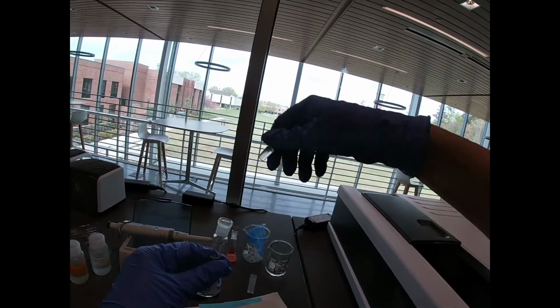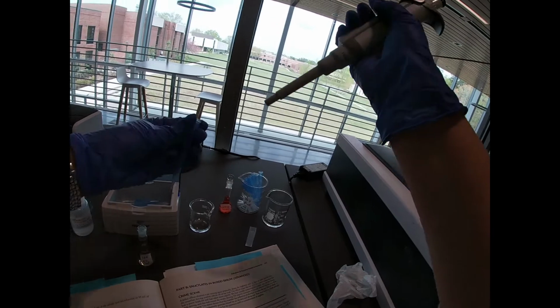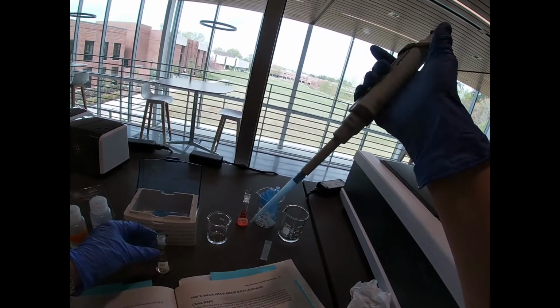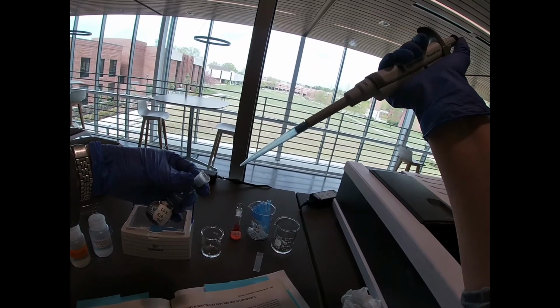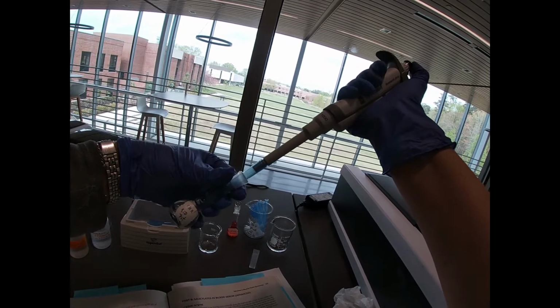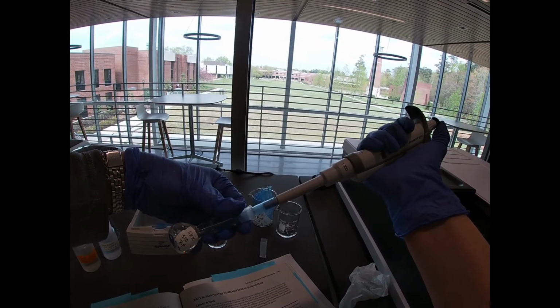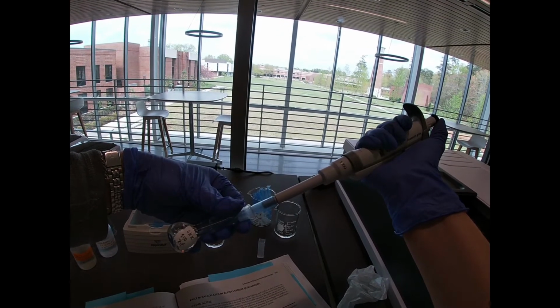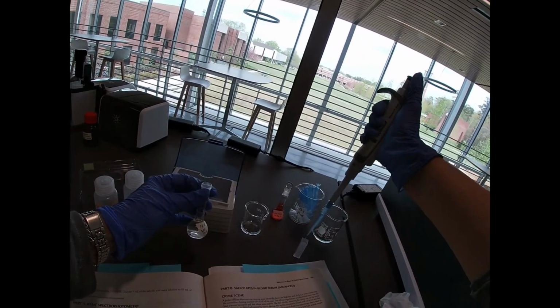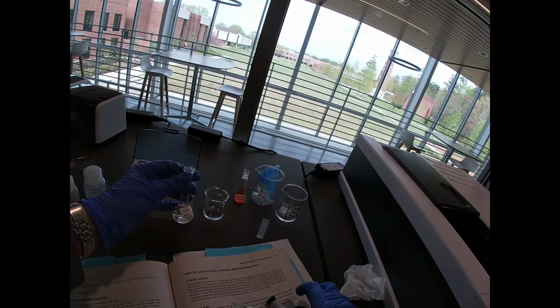And we're going to take our check standard. Hopefully I can get down in there. Alright, so I got a full milliliter of our check standard.